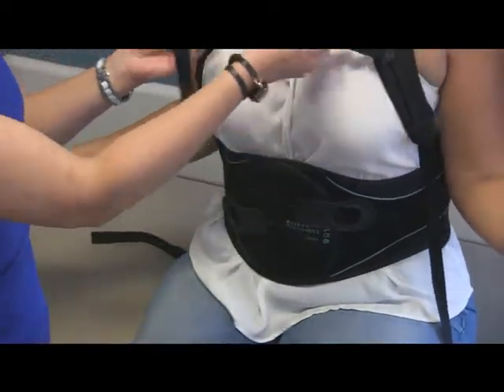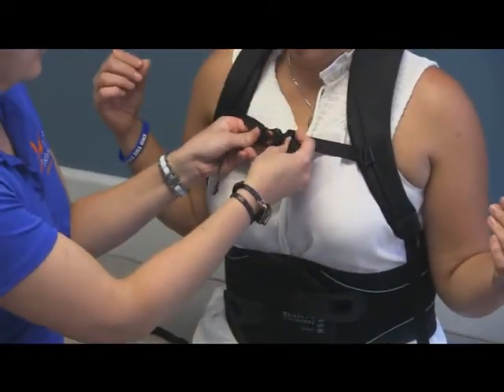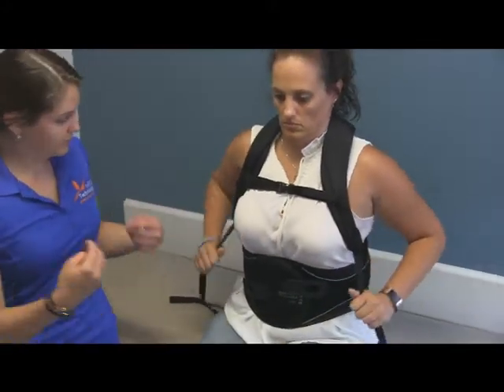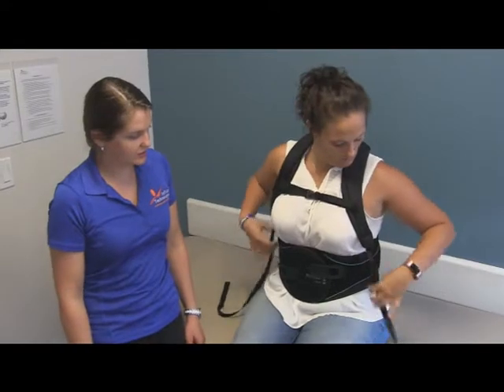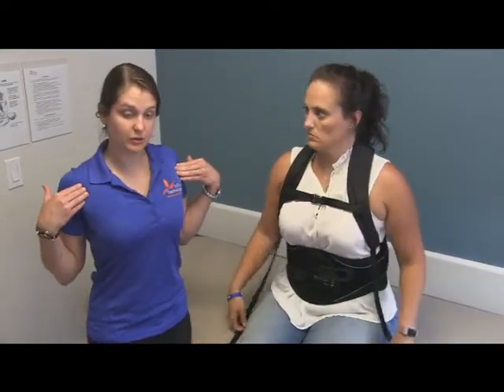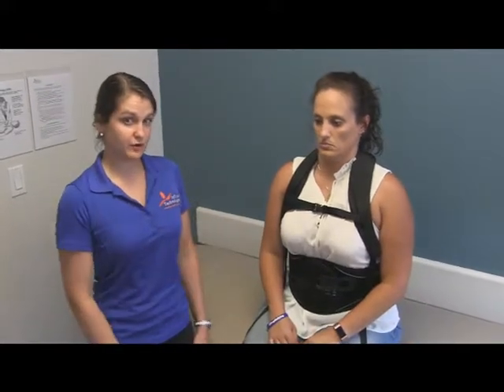The last portion is to just clip these two shoulder straps together. They're going to get snapped together right in the front, and the shoulder straps may need to be adjusted to be a little bit tighter if they become loose during the fitting process. You want them nice and snug, pulling your shoulders back to keep the upper portion of your back straight.